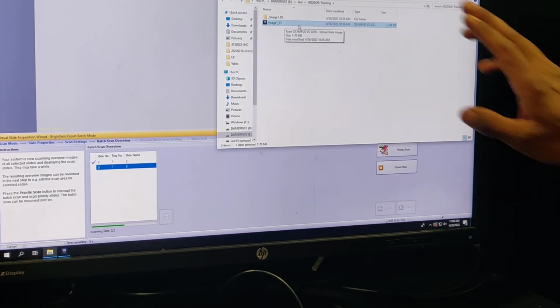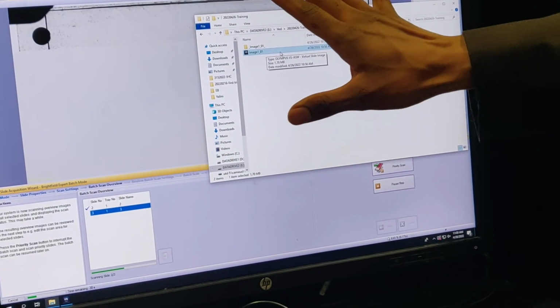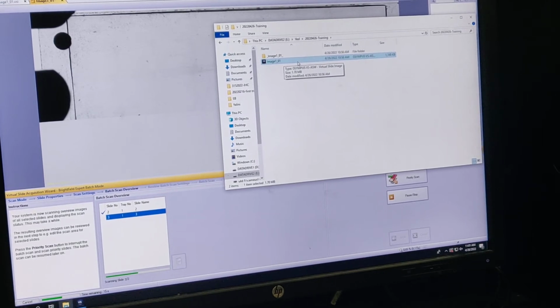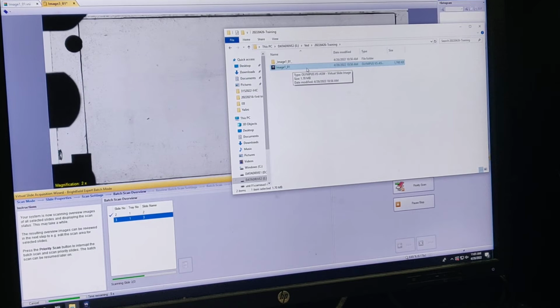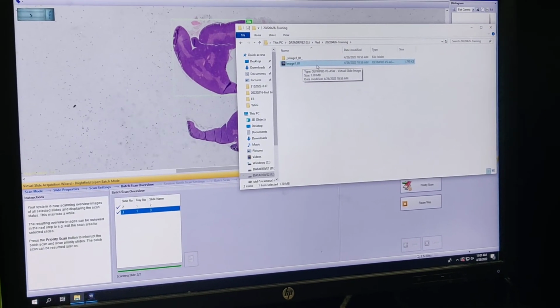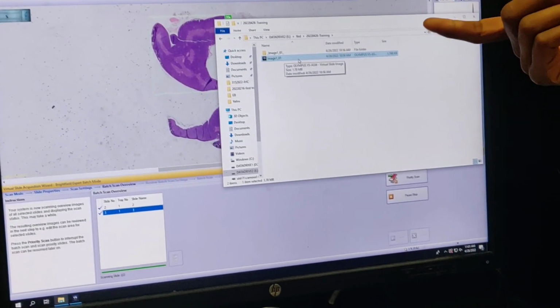Okay. To open this, CellSense is good enough. It is available on this microscope computer. It's available on 3 of the workstations, and also 5 network licenses are there. So it becomes very convenient for people to use it. Apart from that, ImageJ also is able to open it, Fiji with a special VSI plugin.